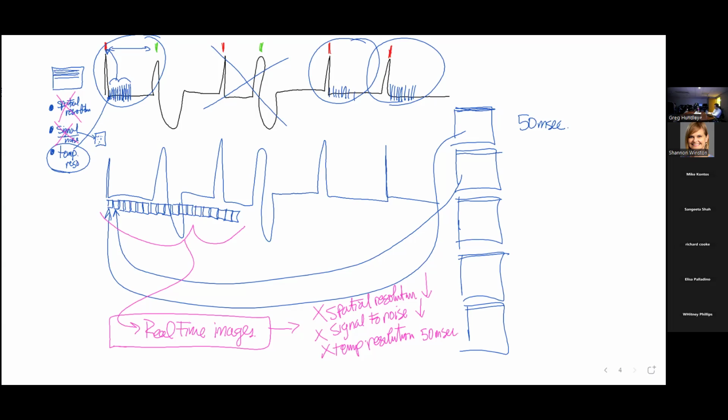We can do the basics, okay? We can give you the LV EDV, the LV ESV, the LV stroke volume, the LV EF, the LV mass, but that's about it with real-time imaging. But it does give you a solution. And it works in a non-cooperative patient, right? You don't really even need triggering. You turn the thing on, you're collecting pictures. Who cares what the triggers are, whether you can see them or not? It doesn't matter. You just turn this thing on. Okay?